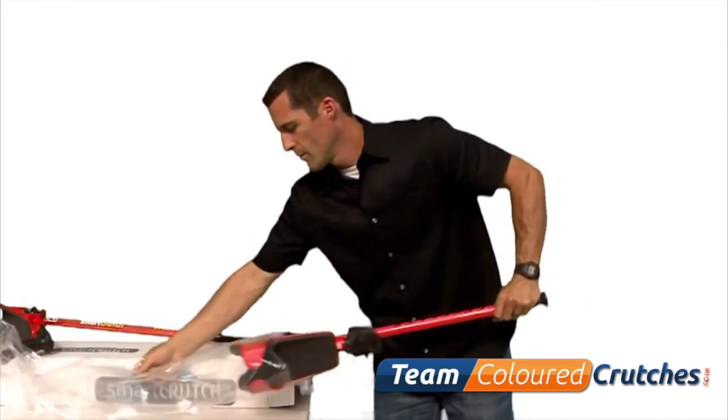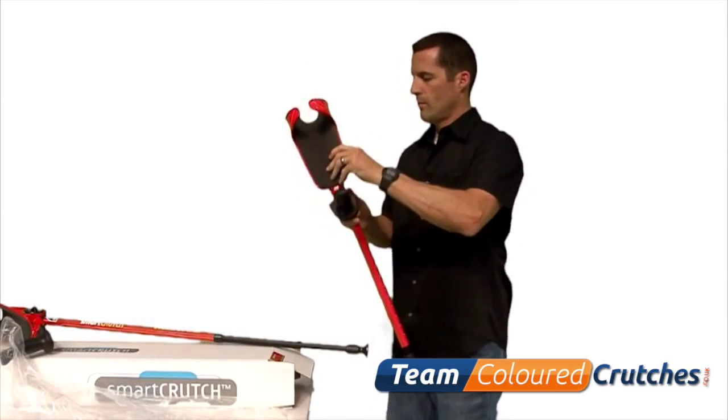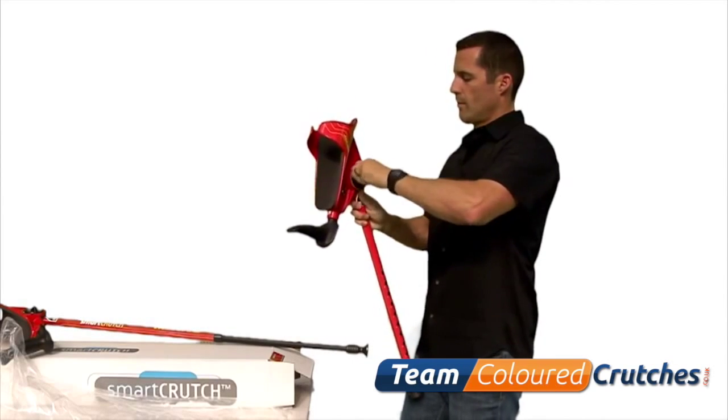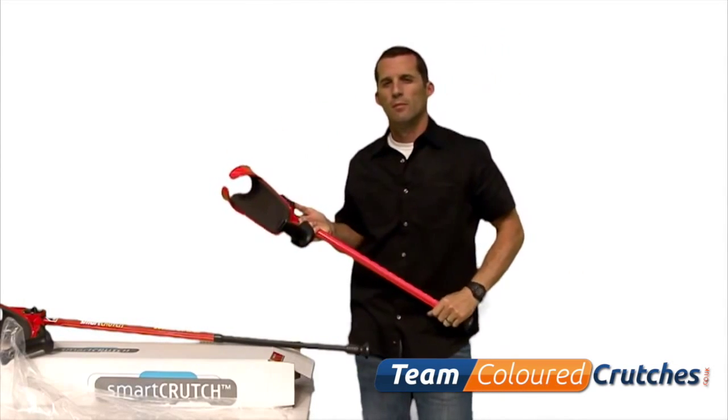Once you have the settings in place with the right side, go ahead and adjust the left crutch with the same settings. Once you have the other crutch set, you are now ready to take the smart crutch for a test drive.